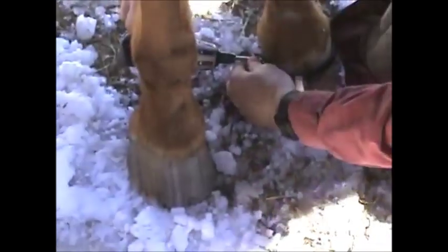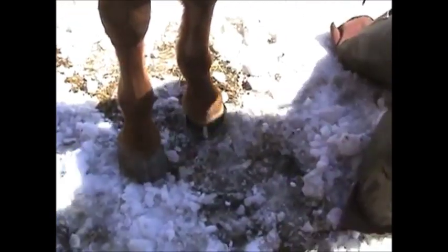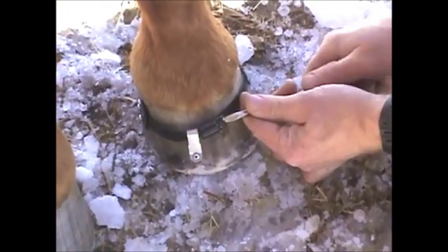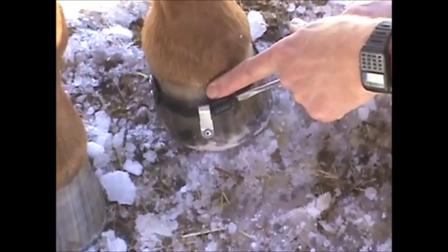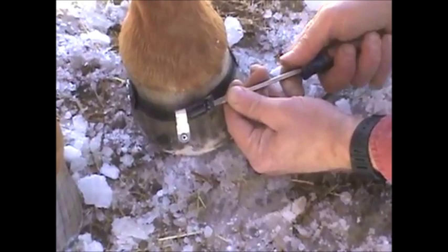Sometimes I can bring their foot forward and put it up on the stand and do this too. Now what we've got to do is tighten it. Tightening is just with a handheld screwdriver — you don't want to use anything else. Get it to where it's starting to snug. I normally feel just above to feel when the hoof wall starts to move. It's starting to move right now. Give it another turn and that's it.